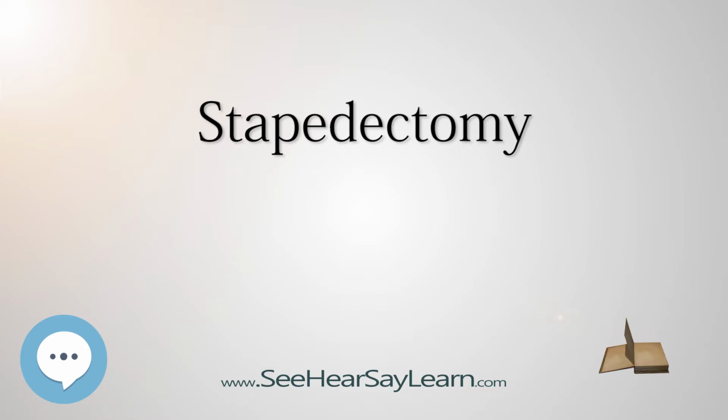Stapedotomy versus stapedectomy. Comparisons have shown stapedotomy to yield either as good or better results than stapedectomy, measured by hearing improvement and reduction in the air-bone hearing gap, and especially at higher sound frequencies, and to be less prone to complications. In particular, stapedotomy greatly reduces the chance of a perilymph fistula, leakage of cochlear fluid. Stapedotomy, like stapedectomy, can be successful in the presence of sclerotic adhesions, tissue growths abnormally linking the bones to the tympanic cavity, provided the adhesions are removed during surgery. However, the adhesions may recur over time. The stapedotomy method is not applicable in those relatively rare cases that involve sclerosis of the entire ossicular chain.